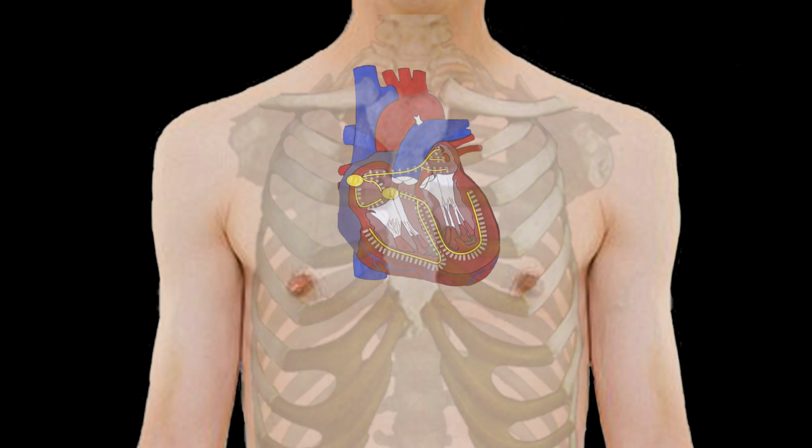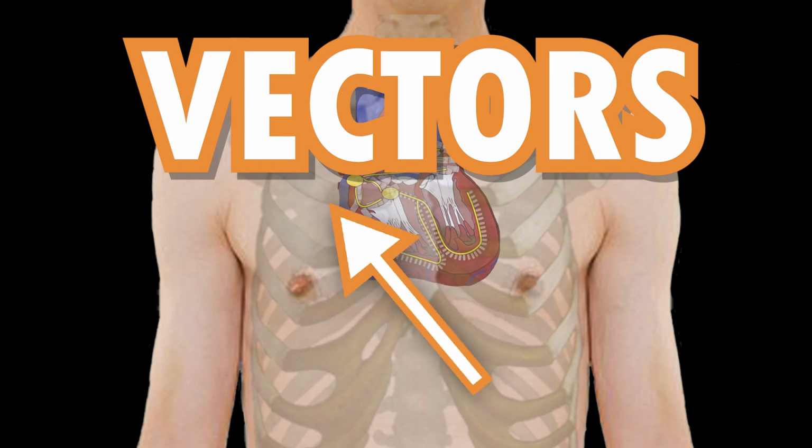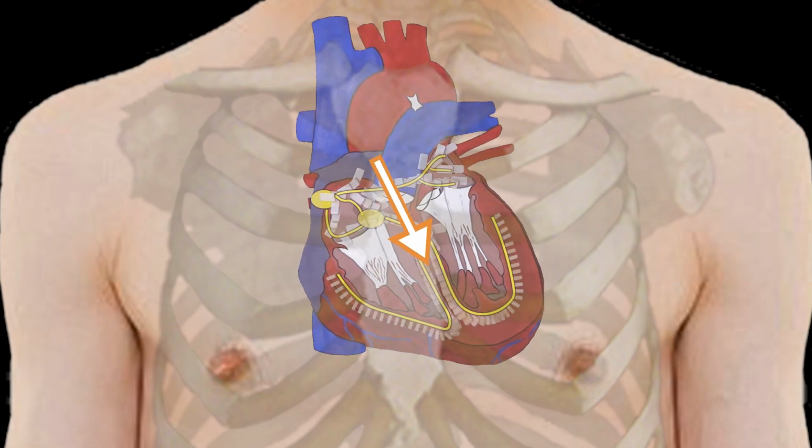These electric fields travel in the same direction as their associated depolarization wave and are of similar size. We usually draw them as arrows called vectors. Vectors have direction and magnitude. But you already knew that, didn't you? The direction of the arrow represents which direction the depolarization wave is moving. The size of the arrow represents its magnitude. This is determined by the number of cells that are being depolarized.